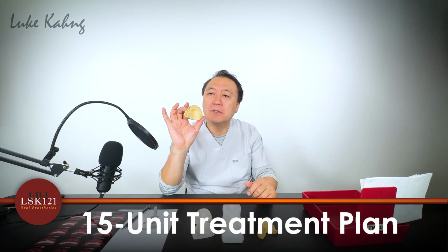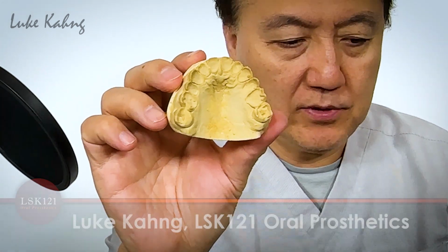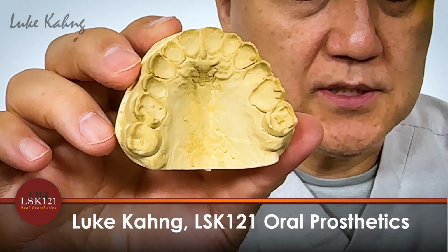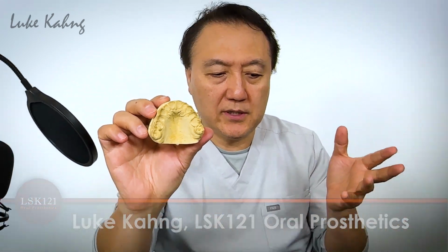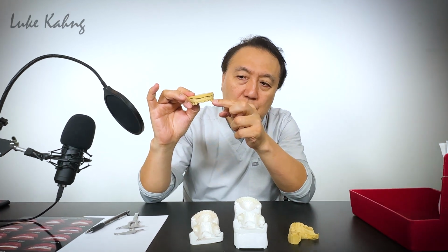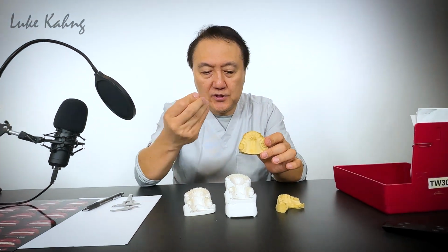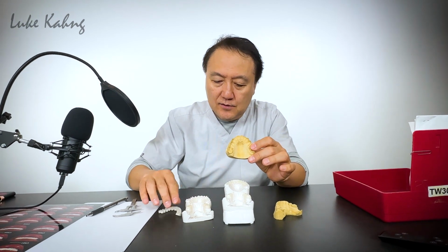I would like to talk about the 15 unit treatment plan cases before we finalize the restorations, which is very imperative: how to rebuild it from the tissue design. Then we give our client a much better idea of what the laboratory can do to produce it better.